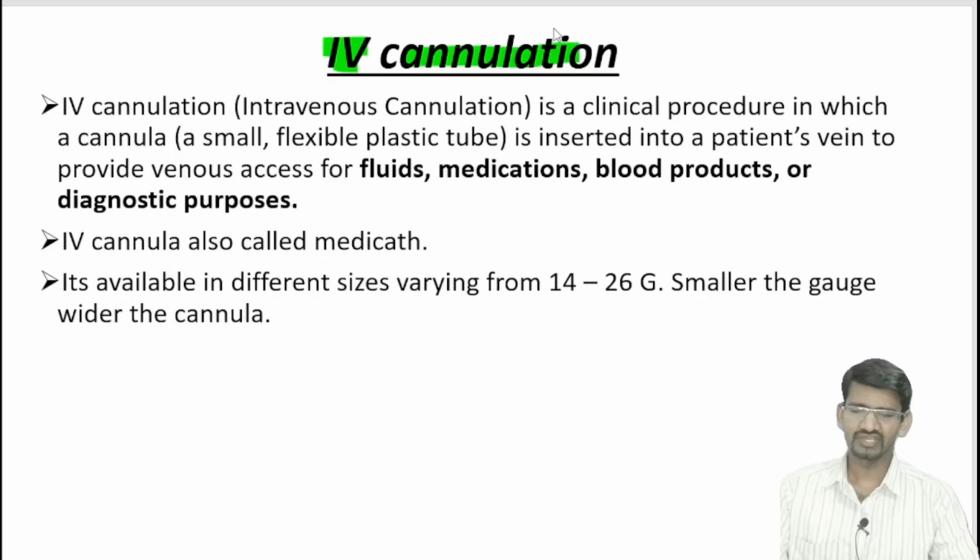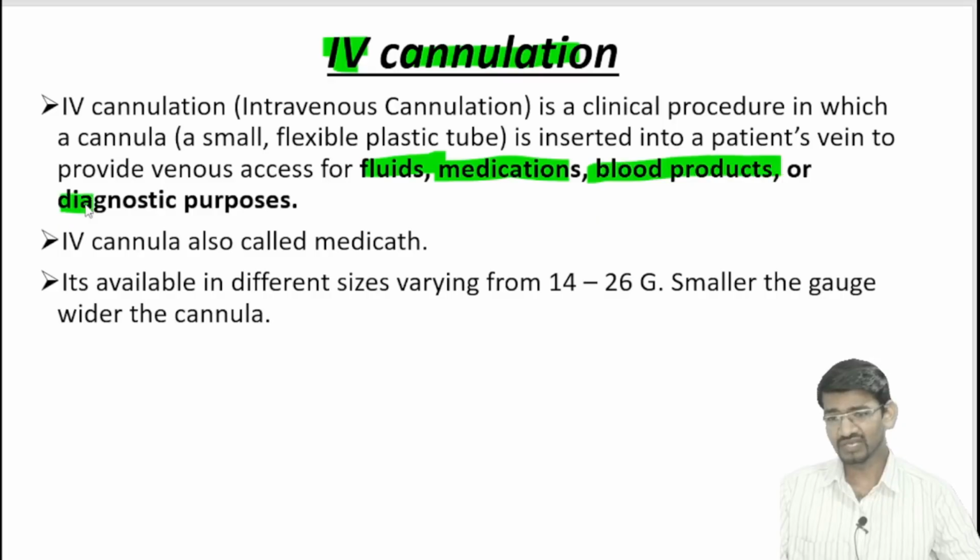A cannula is a very small, flexible, plastic tube that is inserted into the patient's vein to get venous access, for the purpose of fluid administration, medication administration, administration of blood or blood products, and even for some diagnostic purposes we do IV cannulation.